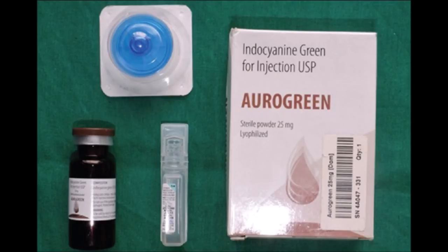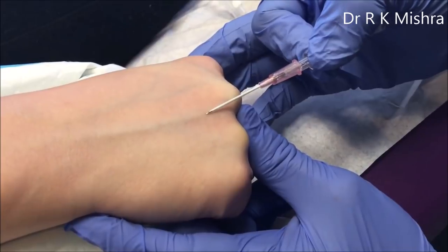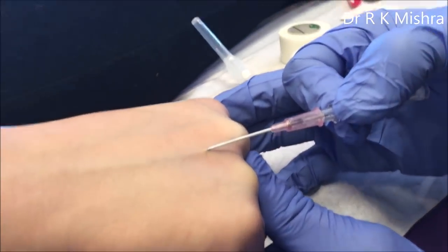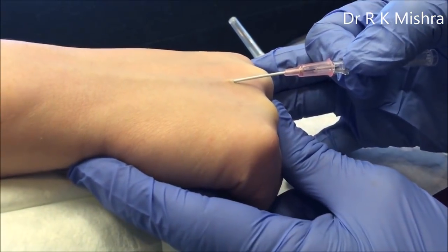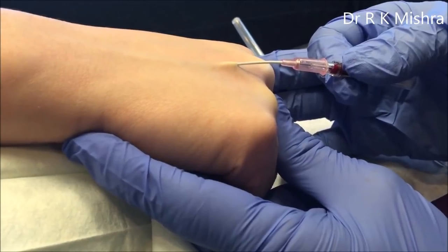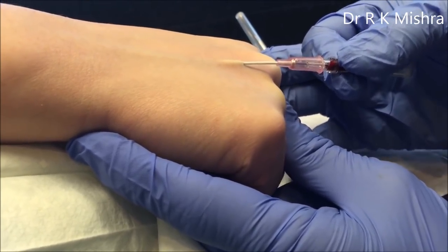This ICG has to be administered 1 ml, that is 45 minutes before starting the procedure. It has to be given in any of the peripheral veins.